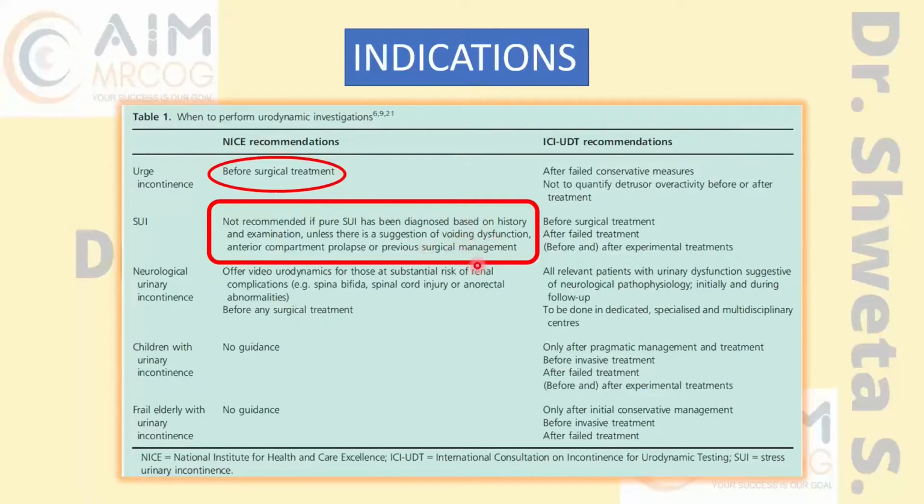So you have to understand these three points for when to choose urodynamics as the next step before surgery. Am I clear about this? That is when you will choose urodynamics in SUI? Okay, great. Now, what about video urodynamics and ambulatory urodynamics?